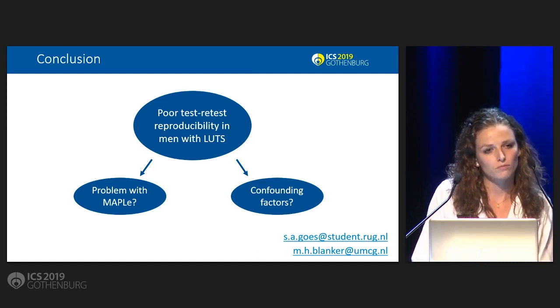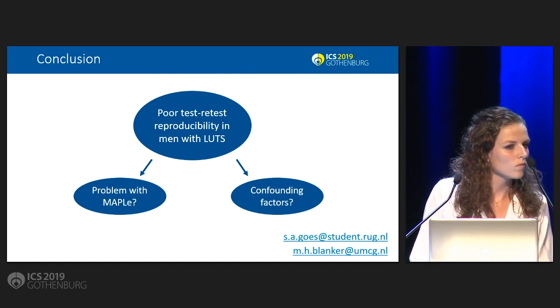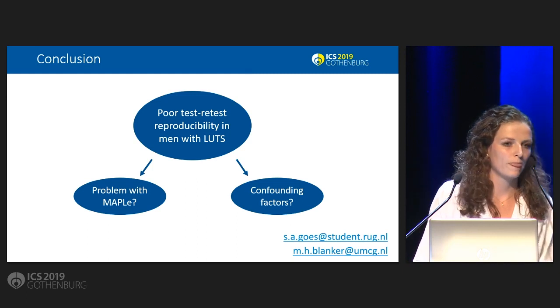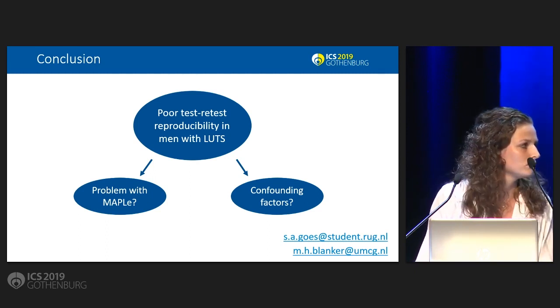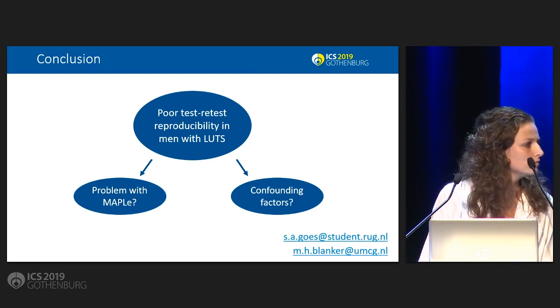And one other question is, was the patient blinded for the screen? How do you mean? Could the patient see what he was doing at the moment he was doing the rest, MVC, or endurance? No, he was not blinded to the screen. He was seeing the screen for the instructions as you provided in the MAPLe app. So he was seeing if he was contracting and relaxing his pelvic floor. I think the video shows the time frame for the contraction. Yeah, and it shows the contraction itself.